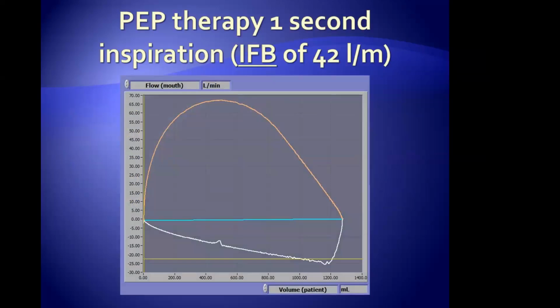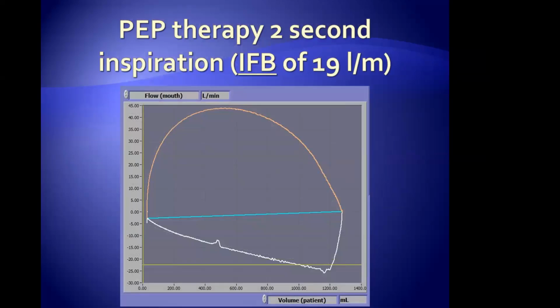Again, waveforms. I love waveforms. So here it is. See, there's no waveform because I've applied that peak pressure. There's not that oscillation. Remember the slides before where you see the wave? It's not there because I've applied positive expiratory pressure. It's flat. So I need to do a little more. Think about where am I at? How am I helping with this?